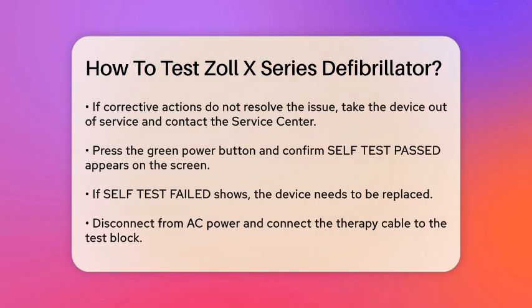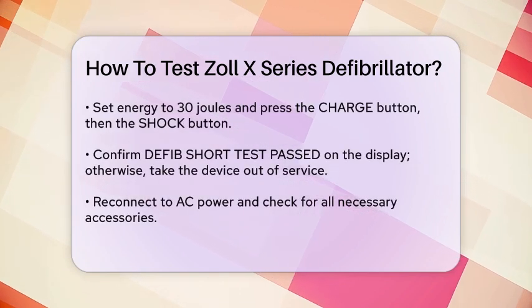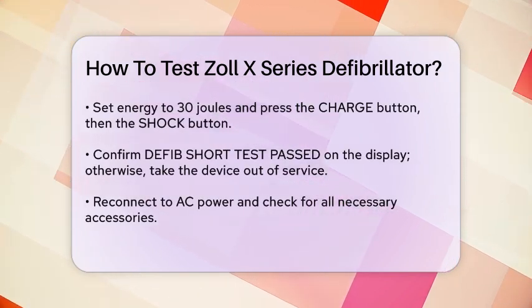Disconnect the defibrillator from AC power and connect the therapy cable to the test block. Set the energy to 30 joules using the energy select buttons, then press the charge button. When you hear the ready tone, press the shock button until the shock is delivered. If the display shows 'defib short test passed,' the device is ready. Otherwise, it needs to be taken out of service.